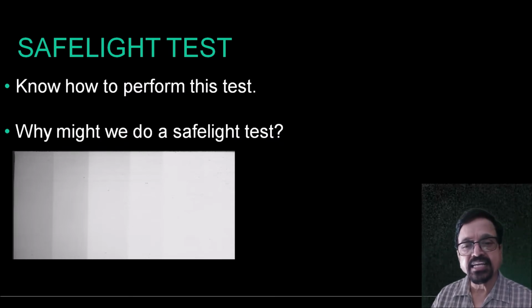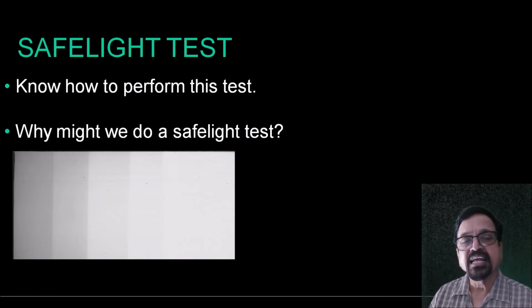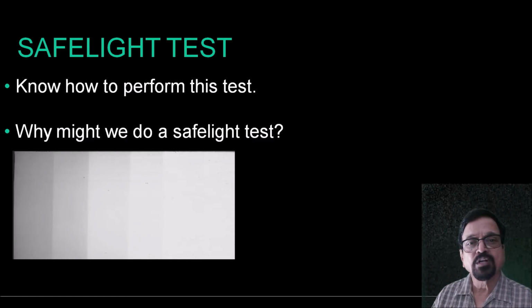Now you are seeing here gray shades. The extreme right side is the white and then are the gray shades. You should not get the extreme gray shades. You should get something in between these two. That also as far as possible should be avoided, and best if you get first white or next to it. And usually it can be achieved. It is not that difficult to achieve, provided we know how to achieve it.